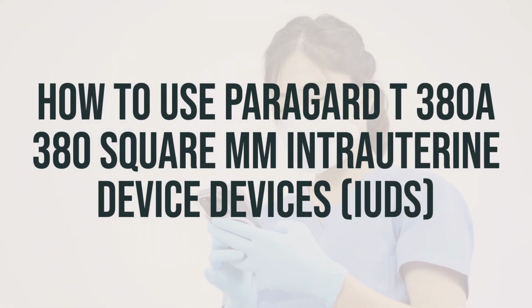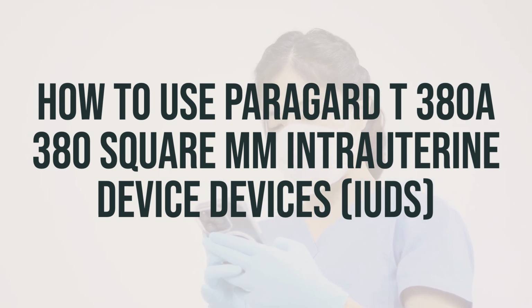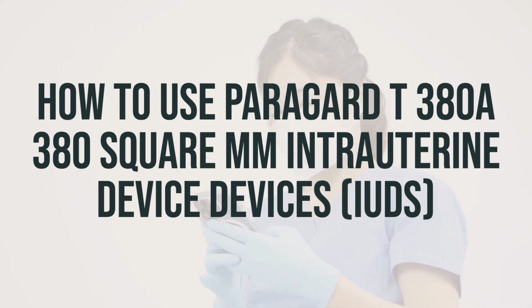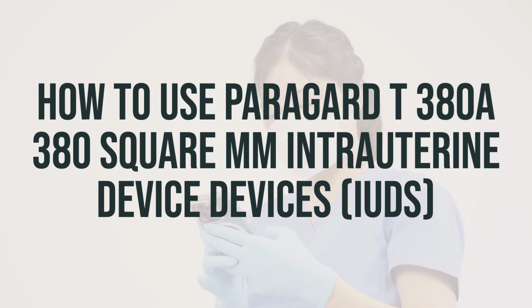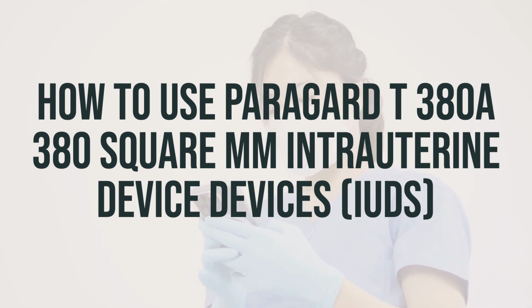Before using Paragard T380A 380 square mm intrauterine devices, IUDs, make sure to read the patient information leaflet provided by your pharmacist. This device is inserted into your uterus by a healthcare provider and can stay in place for up to 10 years. After insertion, you should schedule a follow-up visit after your first menstrual period to ensure it is properly positioned. It's important to check the position of the device once a month to make sure it hasn't moved.